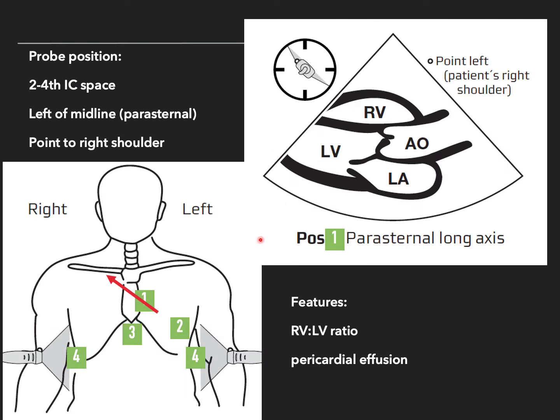The parasternal long axis view is obtained with the probe marker towards the patient's right shoulder, with the probe in the second, third, or fourth intercostal space on the left side of the sternum. In this view I expect to see the right ventricle on top, the left ventricle at the bottom, the left atrium, the aorta, the mitral valve, and the aortic valve. The apex of the heart is not expected to be visible. This view gives an idea of the RV-to-LV ratio, pericardial effusion, and global LV function.